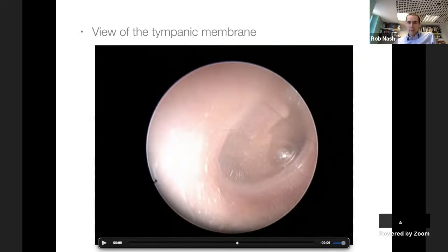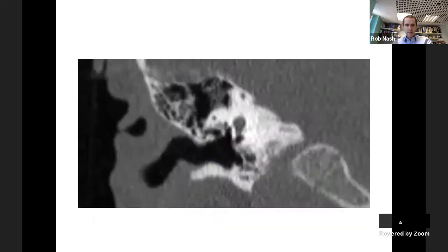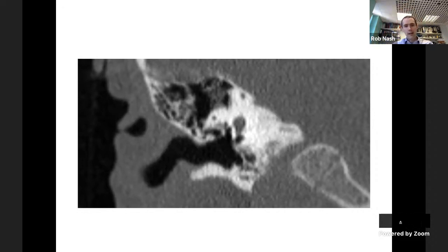The pars flaccida is at the top and the pars tensa is this bluey-grey disc which is slightly transparent - to the extent that you can sometimes see structures deep to it. You can sometimes see the ossicles. Because of the angulation, you can see the anterior part of the middle ear more clearly - probably the anterior cochlea or the carotid artery. The eustachian tube orifice gives you a clue about what's behind the ear.